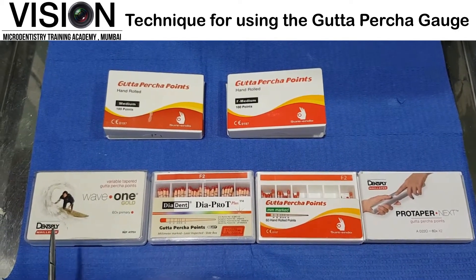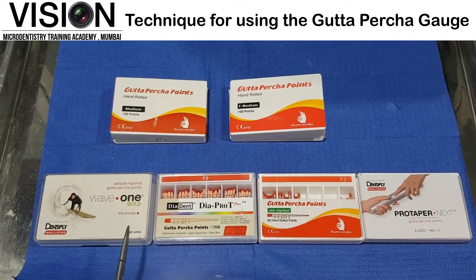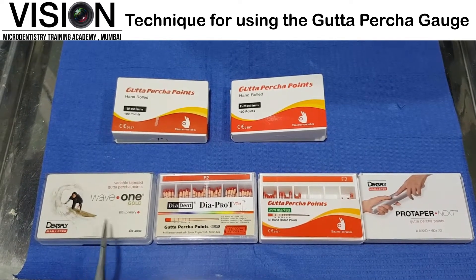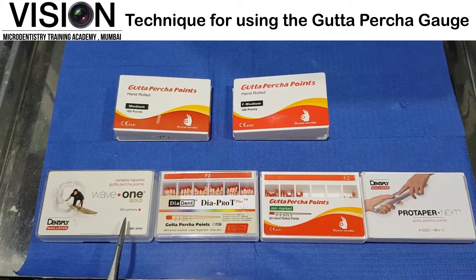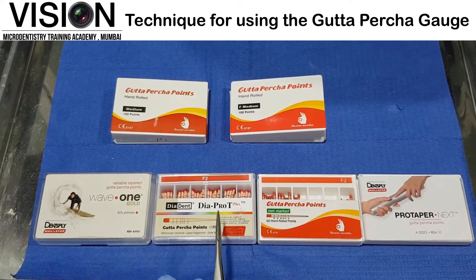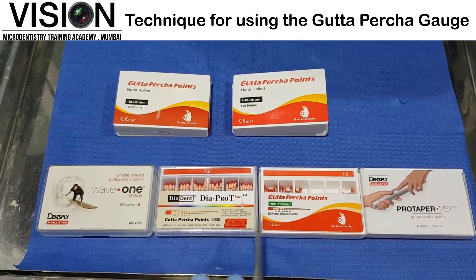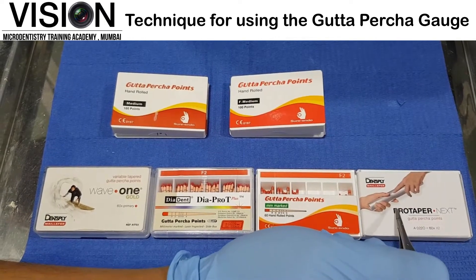In the bottom row here, we have some points from different manufacturers which are designed to be used with a particular file system. For instance, we have WaveOne Gold primary points, which are compatible with the WaveOne Gold primary file. We have ProTaper F2 compatible points from two different companies, and we have a ProTaper Next compatible point from Dentsply.